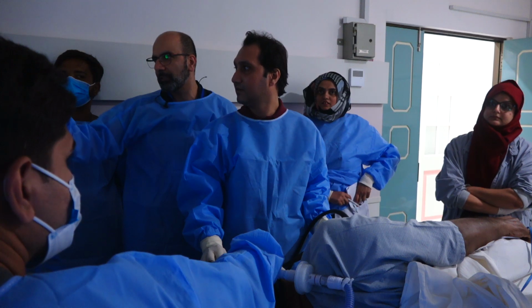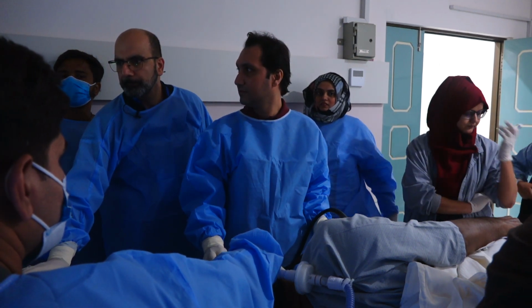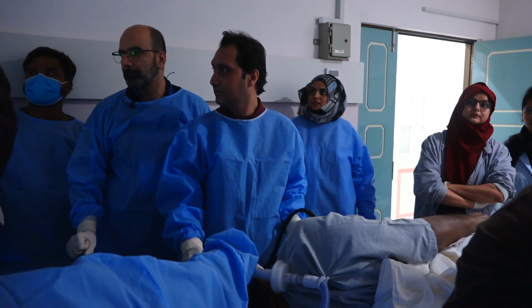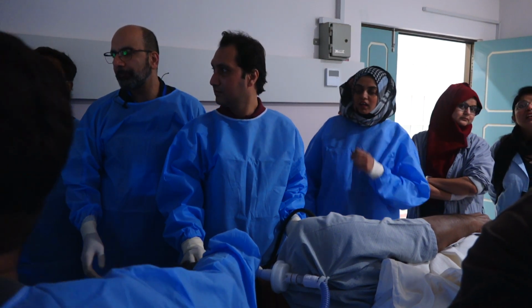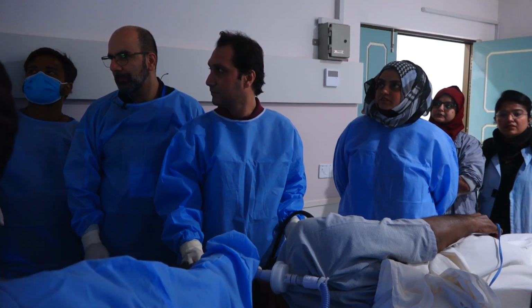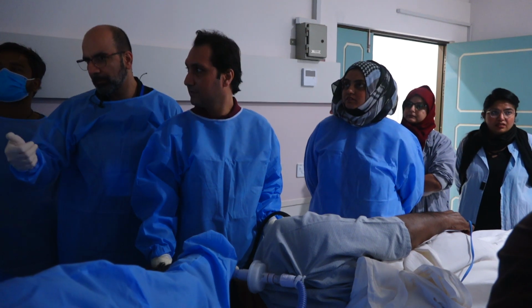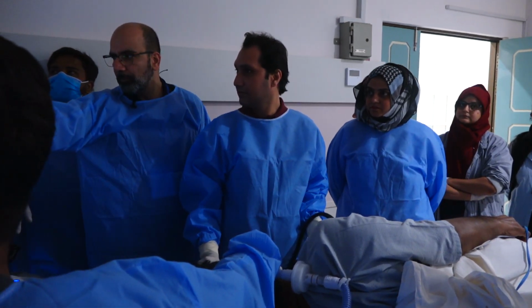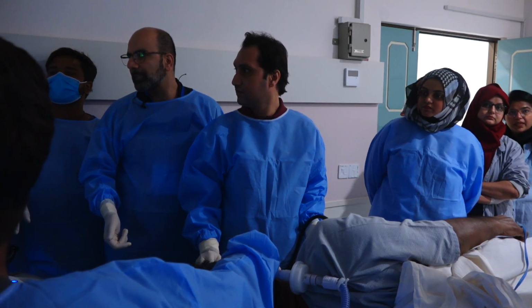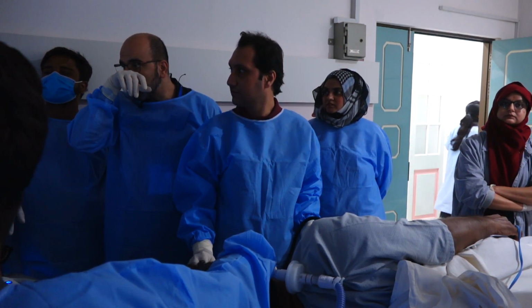So first thing you do is just suction out the EUS stomach. Can you show me the image? You can see the endo image or no? Not yet, one second. Okay, we're just emptying the stomach. Big wheel towards you. Yeah, we can see the EUS image. Pull the scope a bit. Pull back the scope and endoscopic suction. So we're just getting rid of all the fluid in the stomach to begin with. Okay.